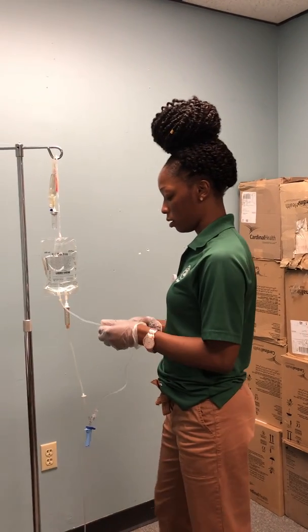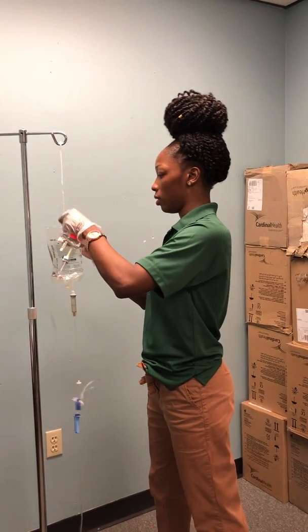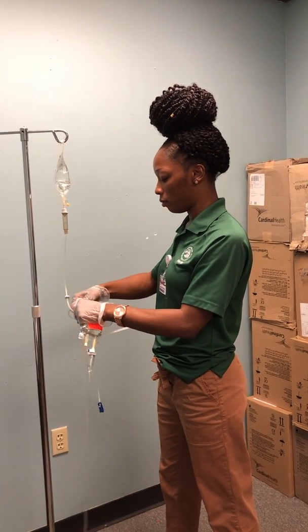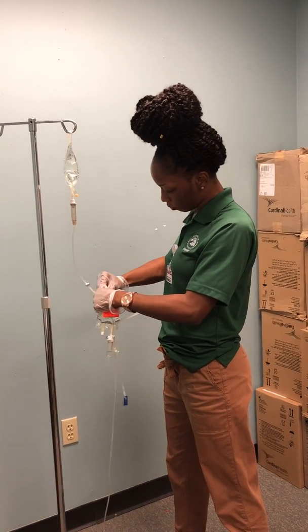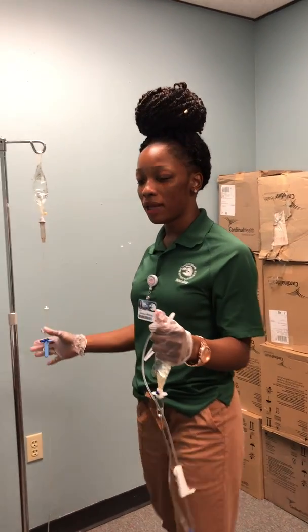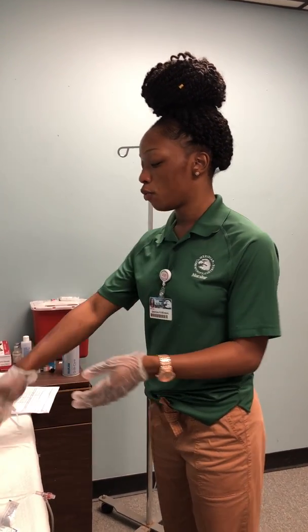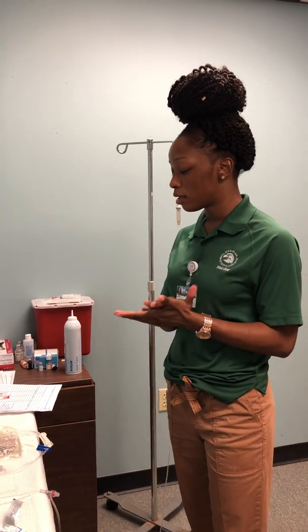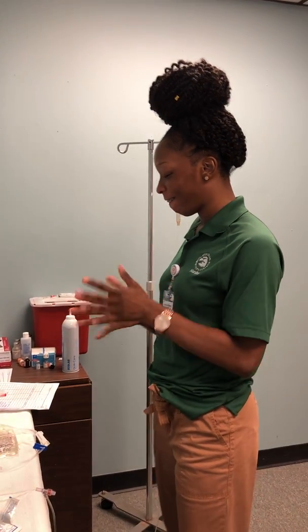Then first I would close my piggyback clamp, replace my primary bag to the top, remove my piggyback. Return the primary bag to the correct rate that it was initially going at. Discard of all my equipment. Wash my hands. Leave my patient safe with the bed as low as possible and side rails up. Wash my hands. I'm done.